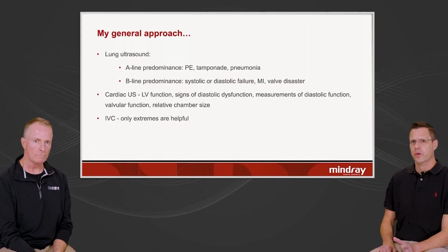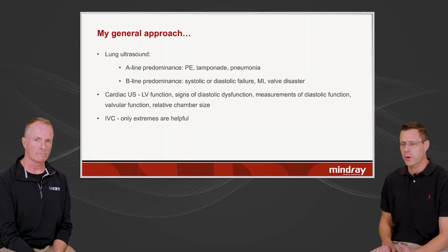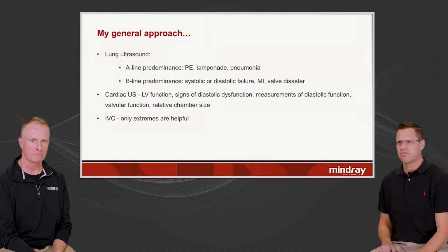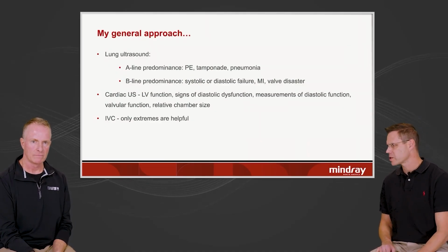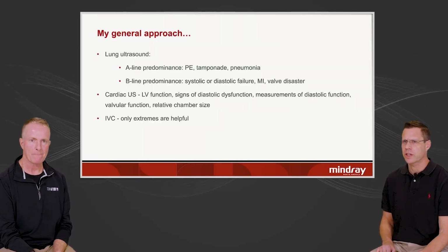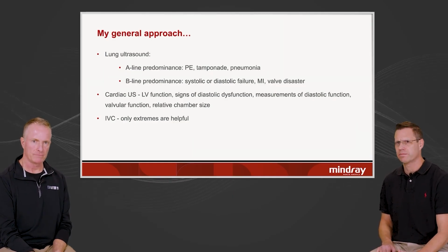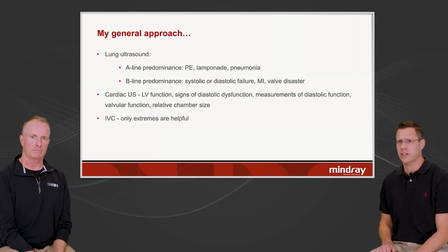And I think with this straightforward approach, looking at the lungs first, where you don't require any window, unlike most other ultrasound, it's pretty simple. You see sliding, no sliding, right? Do you see A lines or B lines? And what's the distribution of those B lines? And it really takes you in certain directions and takes you away from bad directions and bad diagnoses.